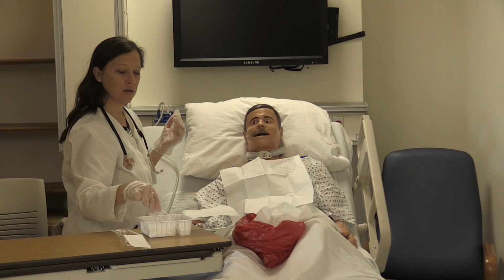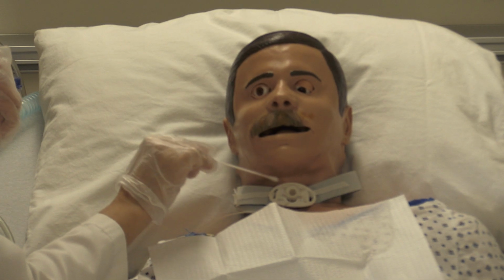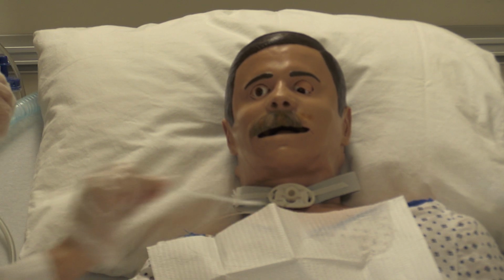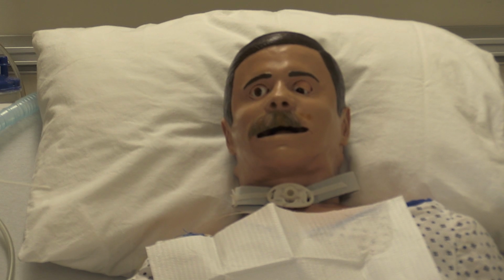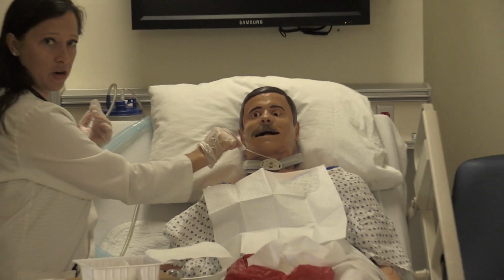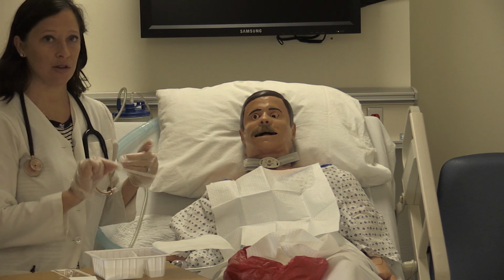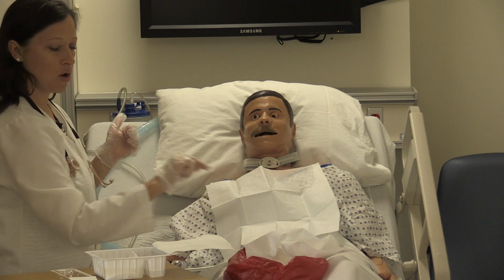And then you're going to get your second Q-tip, and then you're going to go on the top. Distal to proximal, throw it away, get another one, go on the inner cannula side, get that, distal to proximal, throw it away, get a new one, distal to proximal on the top, throw it away, get a new one. It's also important to get underneath the cannula, like underneath by the stoma, distal to proximal, throw that away, get a new one, and then distal to proximal underneath. And you're also assessing the whole time. So you're assessing what the stoma looks like, assessing what you're cleaning, all of that. And then throw that away.